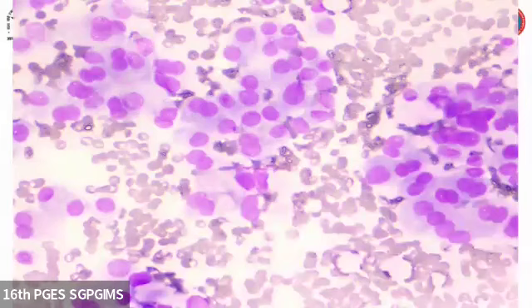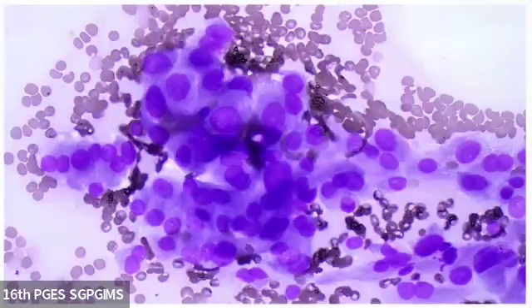However, few of the smears show columnar-like tumor cells. These tumor cells have basal nuclei and an abundant amount of eosinophilic cytoplasm. This is a further higher view, displaying the columnar type of cells which are elongated and have basal nuclei and apical abundant granular cytoplasm. These cytomorphological features give the clue about the tall cell variant of papillary thyroid carcinoma.